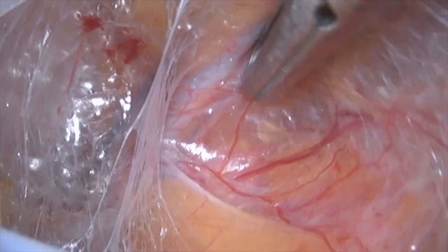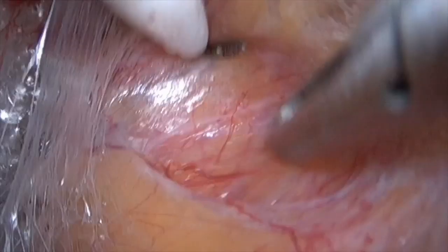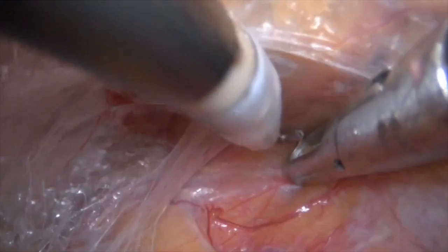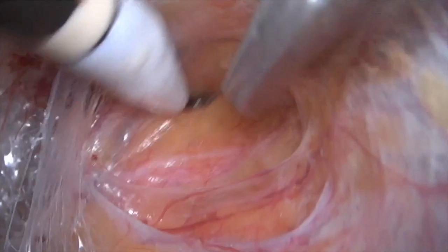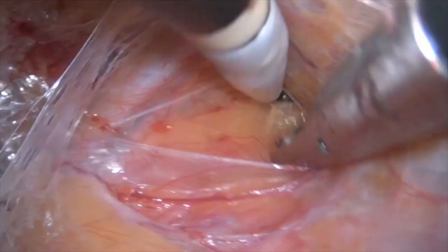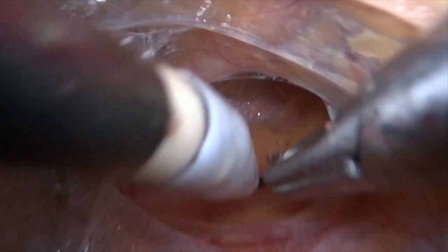So you go close to the vessels and open up with both your instruments. This is the safe way of opening the Bogros space without causing any injury to the peritoneum. So you can see how the movement of my instruments are. This is a very good movement which you can apply in TEP repairs to open up the space in a blunt fashion without much of a worry of injury to any structures.